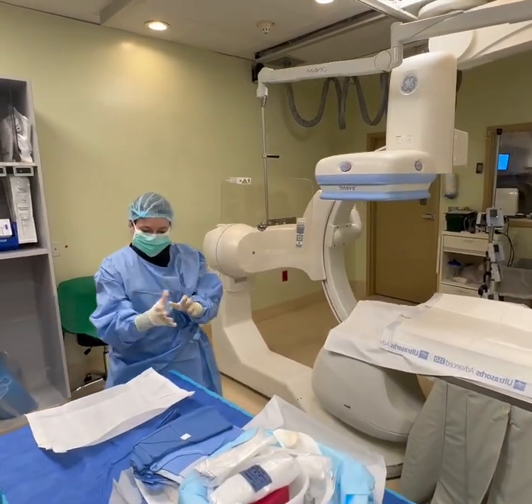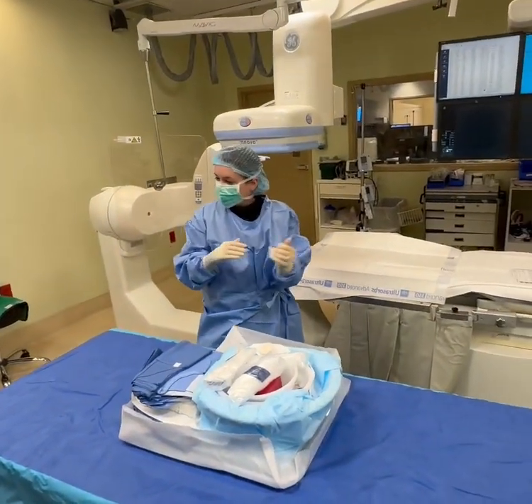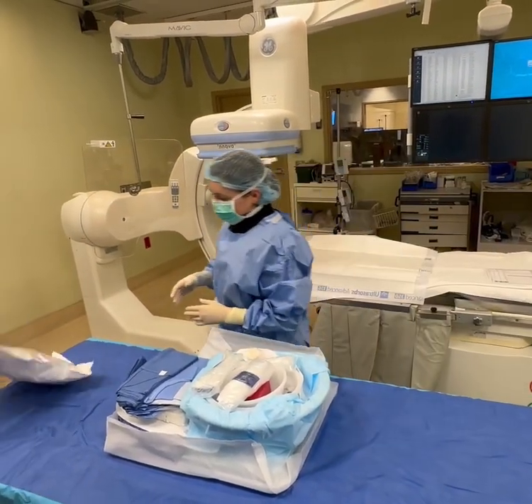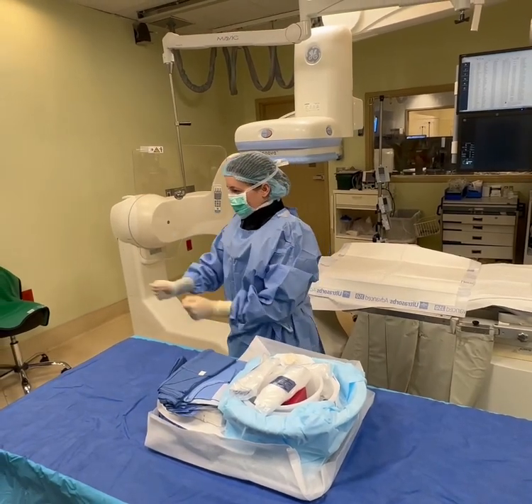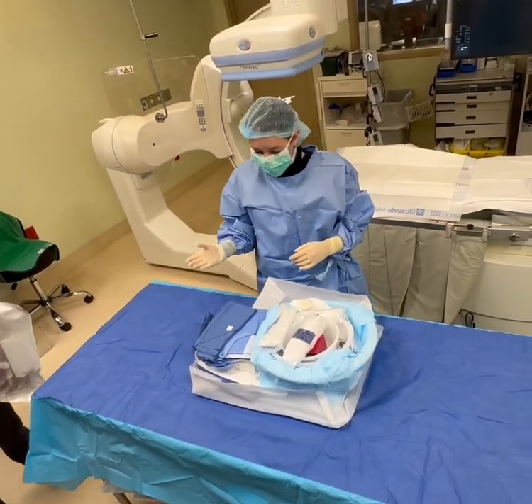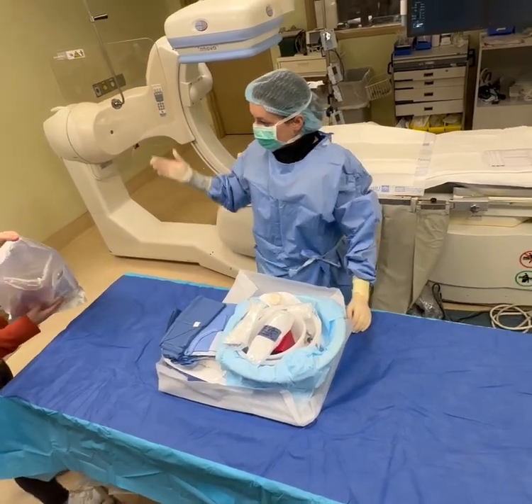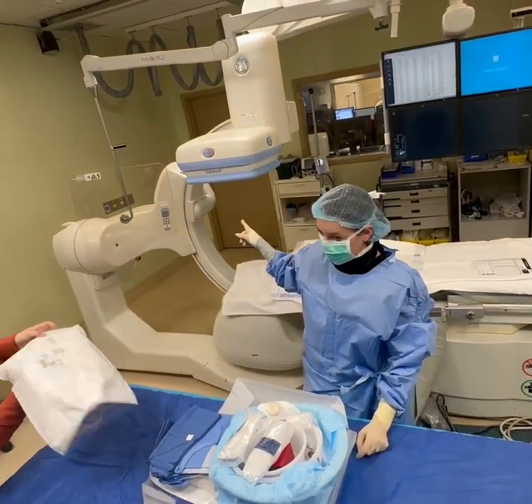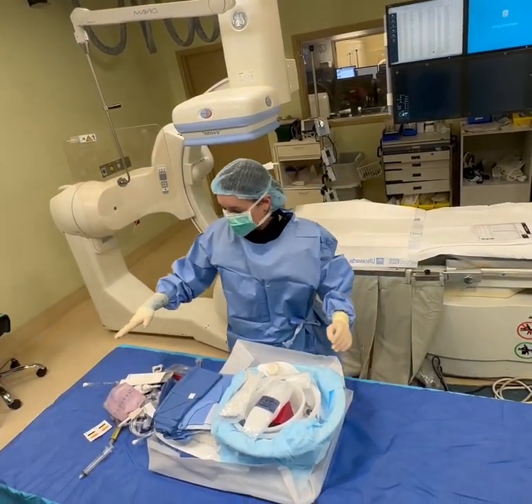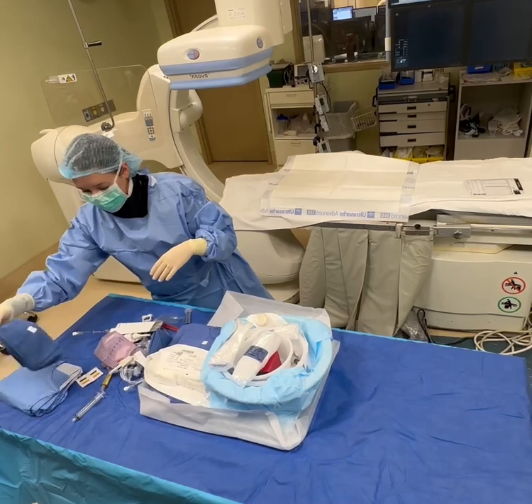All right, now while I'm getting my table set up, somebody's going to go ahead and throw me my manifold kit. While she's dumping my manifold kit, I'm going to set this up in the order that I know that the doctor comes in. The doctor in this room is going to come in from the monitor station. His lead is hanging up right there. And originally I would have the doctor's gloves, okay? So the doctor gets his set of gloves, the gown, sterile towel.